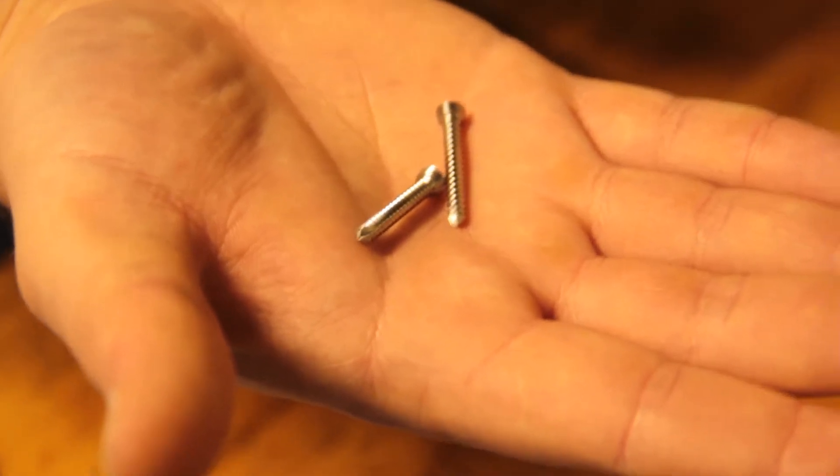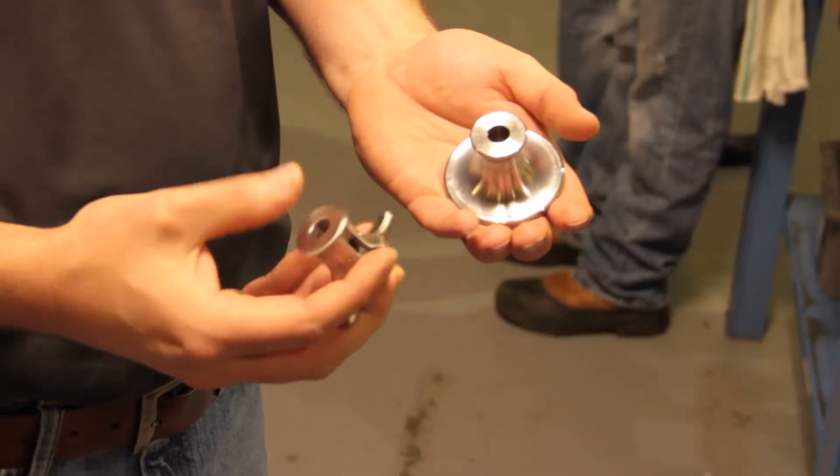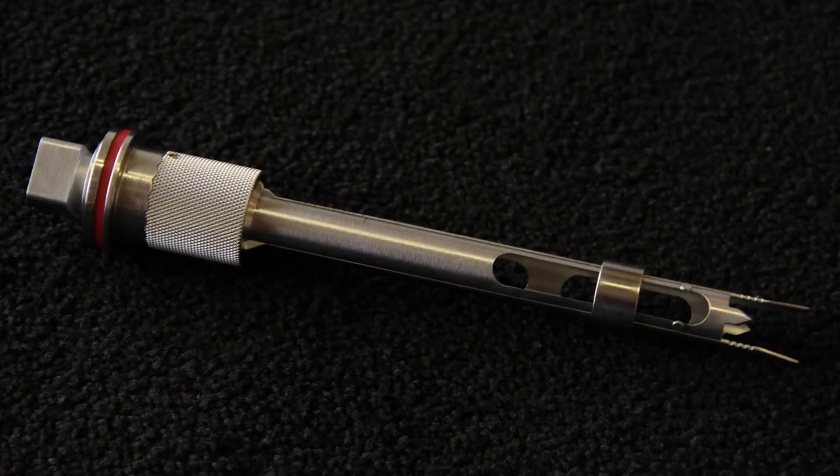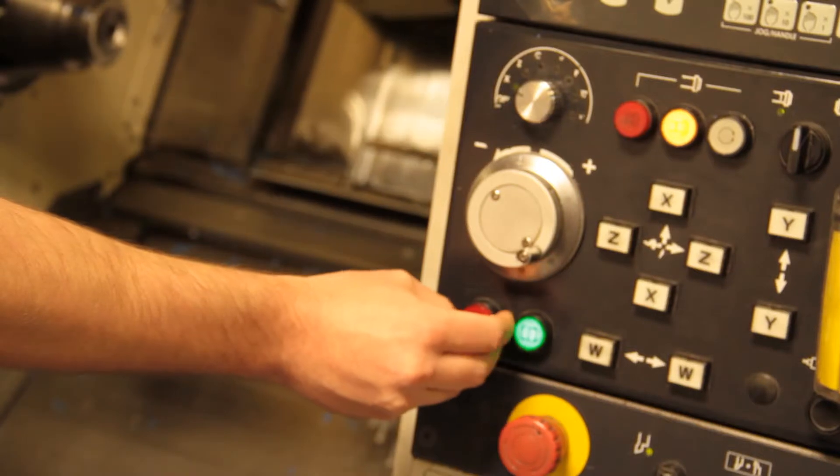We make orthopedic implants such as bone screws and bone plates, shoulder implants, hip joints, and knee joints. We also do a lot of medical instruments that are used during surgeries. It's challenging to be able to do the on-time delivery and give the customer the quality they want. A lot of parts have geometric dimensioning tolerancing with very close tolerances, so we have to take all that into account when we manufacture a part.